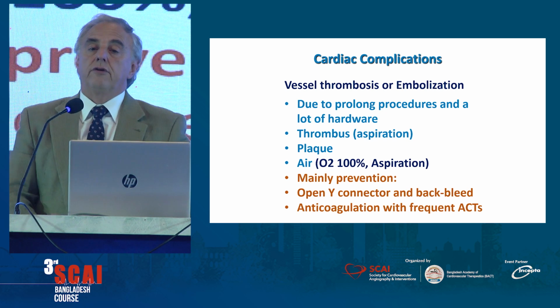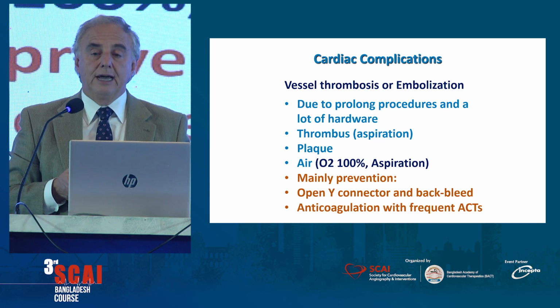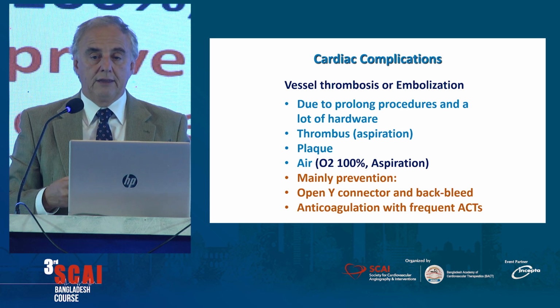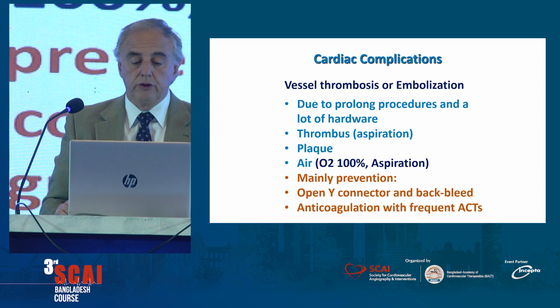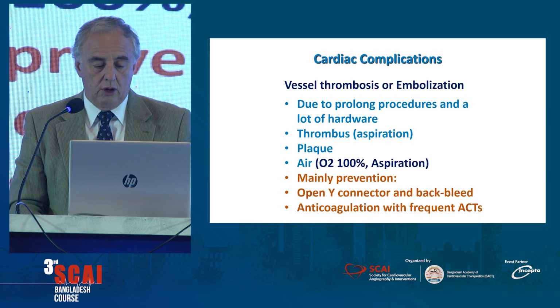Remember that you have a lot of tools in there, and when you try to remove a balloon, many times you are sucking air by a Venturi effect, and if you did not open your Tuohy-Borst to allow blood to come back, you are going to infuse air. Certainly the treatment for that is to try to do air aspiration and give oxygen.